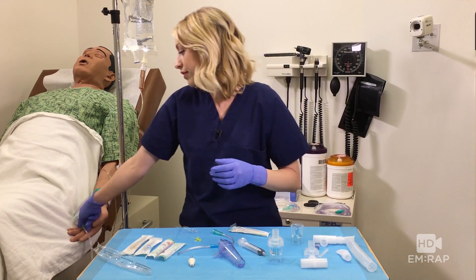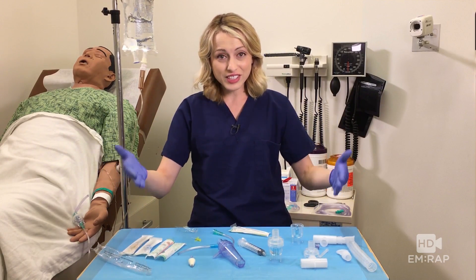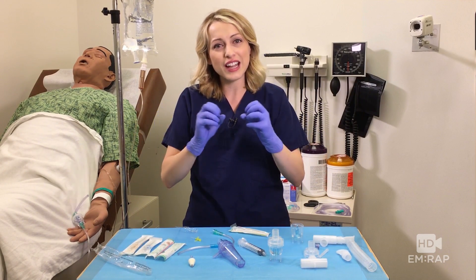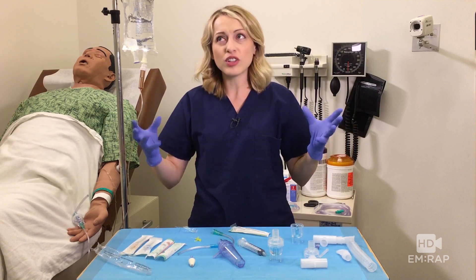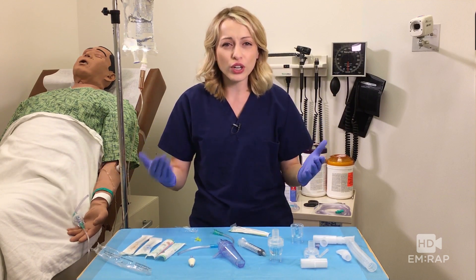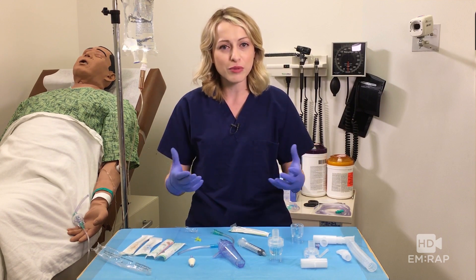Hold on to that for me, Adam — thanks. So we tried all of these different devices and we just really couldn't get a good effect. We couldn't get that nice even spray; it was all pretty much this atomized mist. That's going to work okay if you're just trying to do topical anesthetic of the nasopharynx, maybe for a scope for example.